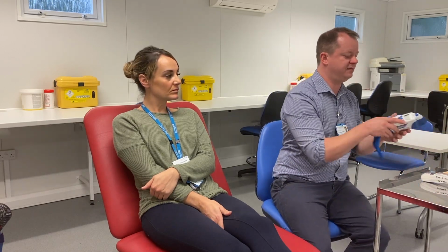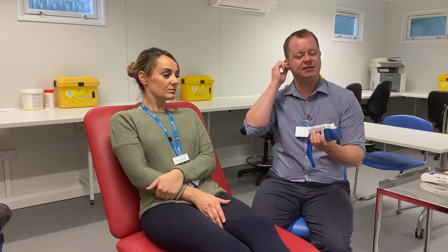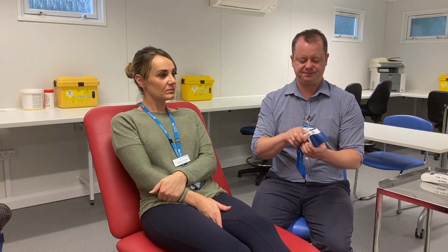Two favourite methods in hospital are the temperature probes that we can put covers on. You'll see that they don't use them in Western Hospital, but you'll note that in vital signs, in all practical skills that we teach you, we're going to teach you lots of different methods that aren't necessarily used at Western Hospital because they might be methods that you use in other hospitals. So at West Suffolk Hospital, we tend to use tympanic thermometers, which are thermometers that you can place inside the ear and they'll look at the tympanic membrane of your ear and they'll be able to record your temperature.